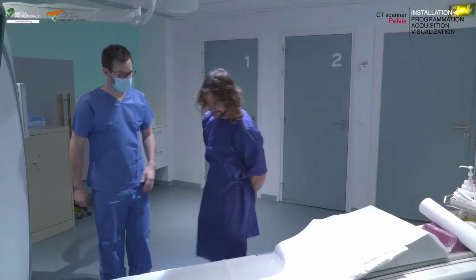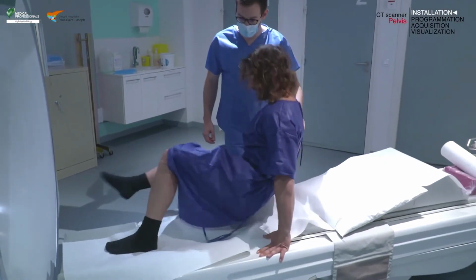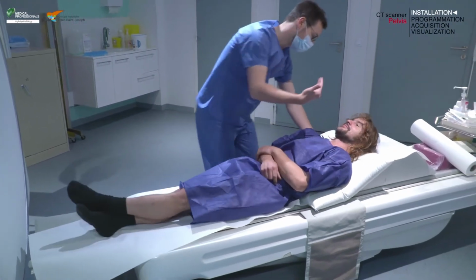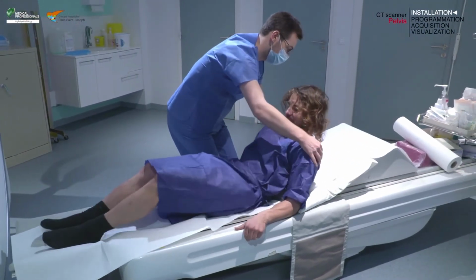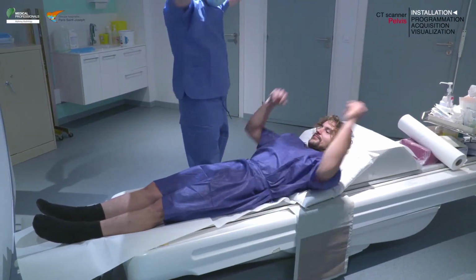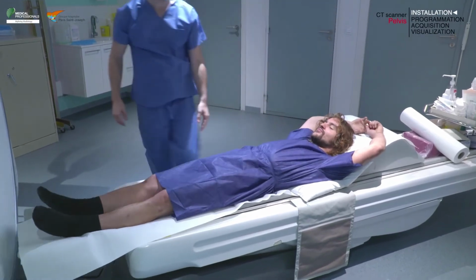After verifying the patient's identity using at least 2 identifiers such as first and last name and date of birth, place your patient in a supine position with their arms above the head. To evaluate for rotation, check that the anterior superior iliac spines are at equal distance from the table.